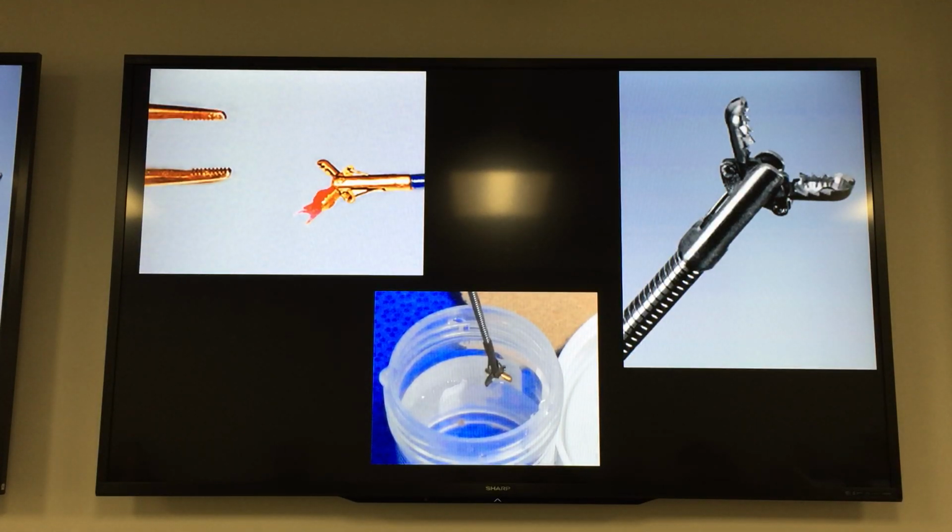How do they get transbronchial biopsies? They use these forceps. You see, that forceps is grabbing hold of a piece of lung tissue like that. These are called, it looks like a particular kind of animal. Can anyone guess? Yeah, alligator. So these are called alligator forceps, or crocodile. I don't think they're called crocodile forceps, but alligator forceps because of their teeth like that.